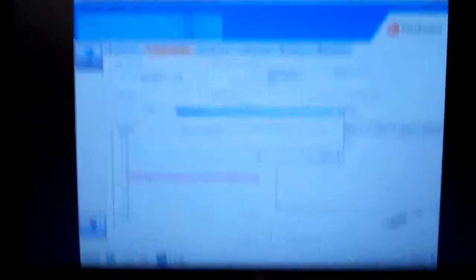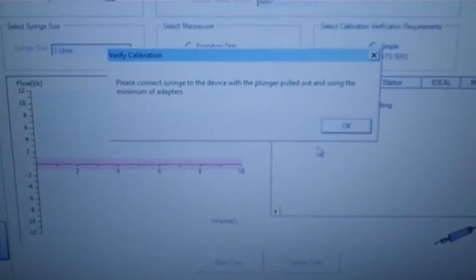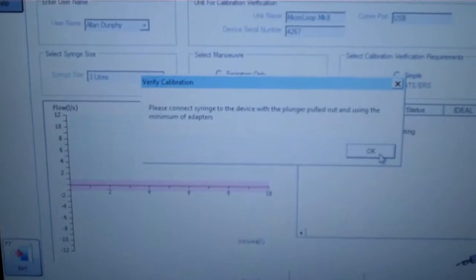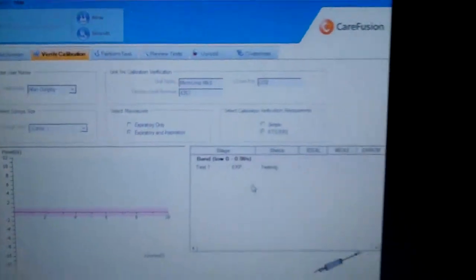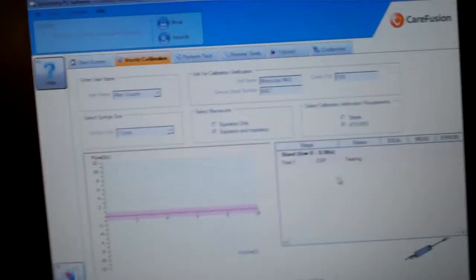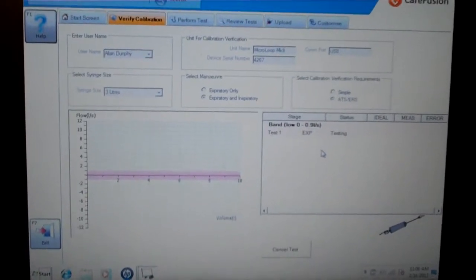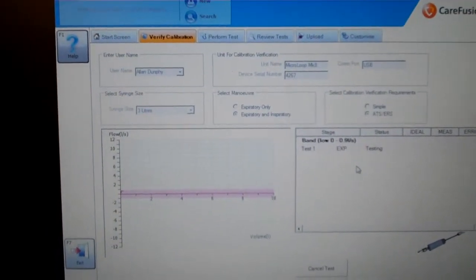At this point I would select OK, and now I need to perform the test. And I will start now.